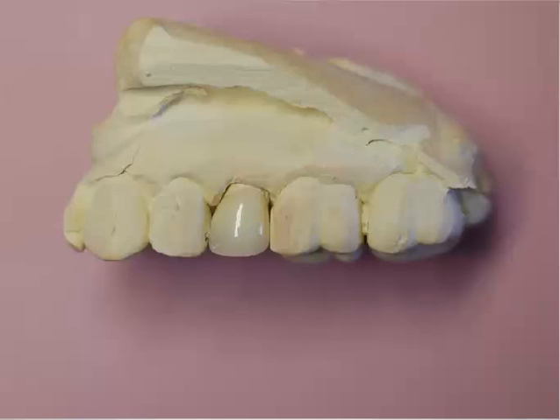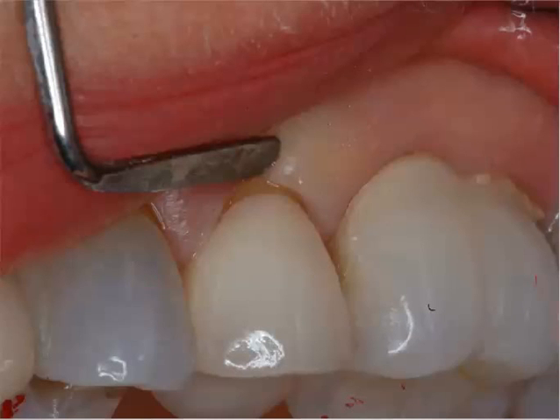Because when we're done with the material, we have a really nice model to deal with, and that is one of the real advantages of the VPS material, because it allows the technician to pour and re-pour these, and they have a solid stone model. They can try things in to check the occlusion, margin, and interproximal contact, and it really aids us when it comes to the final case. Less time in frenzy and frustration at the delivery appointment.